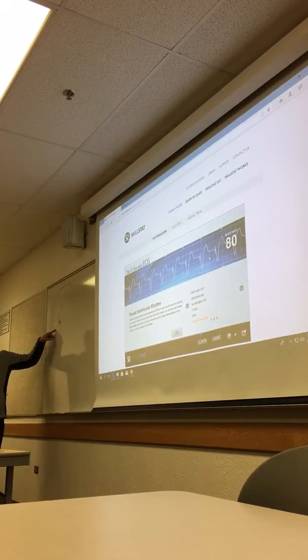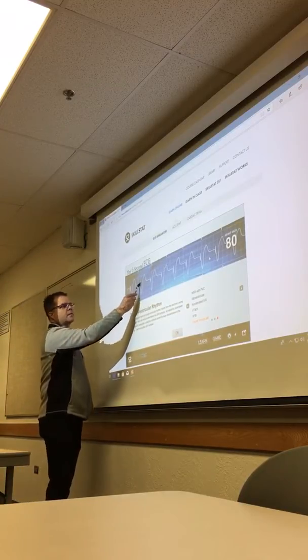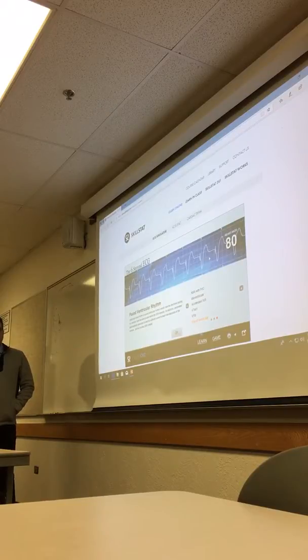If we have a pacer, sometimes there are dual pacers, so we might have an atrial paced and ventricular paced together. So if you see those two little spikes followed by a P wave and followed by a QRS, then they're dual paced. Yep, that's a QRS too. So is the little spike the QRS? No, the spike is the pacer. That whole thing is the QRS. Wow, that's rough. So when you see those great big wide QRSs, this is ventricular, and when you see everything flat in front of it, there's no atrial going on.